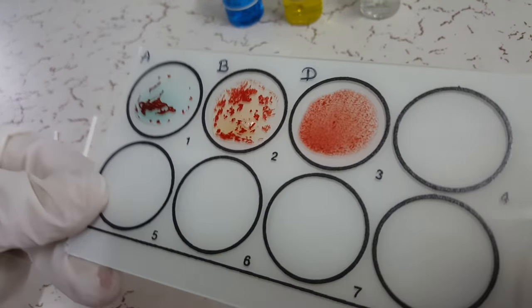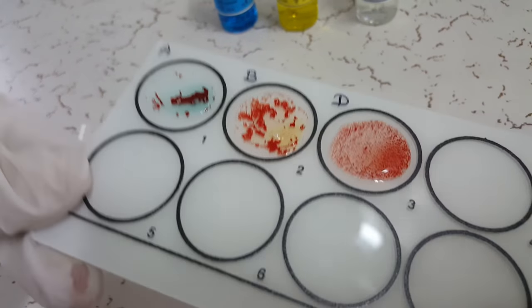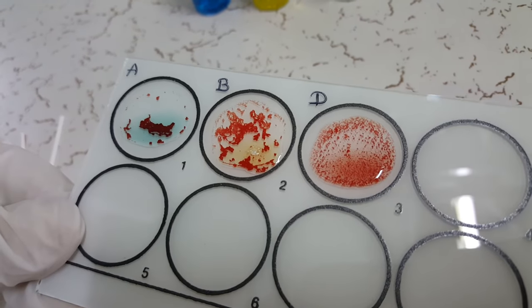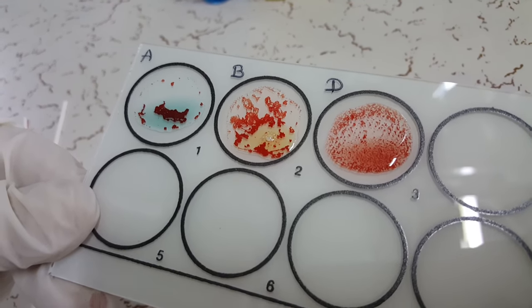As seen in this video, a clear cut agglutination can be seen on all the three circles. Hence it can be concluded that this patient is AB positive blood group.